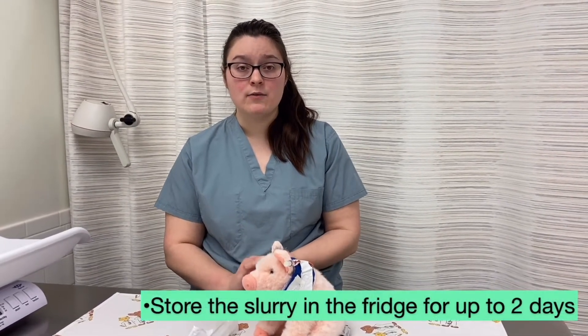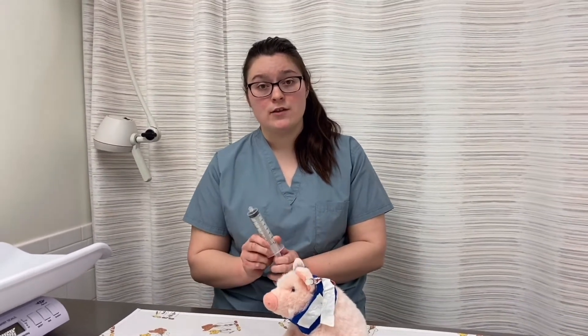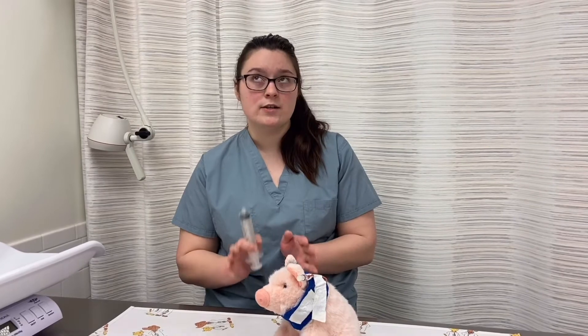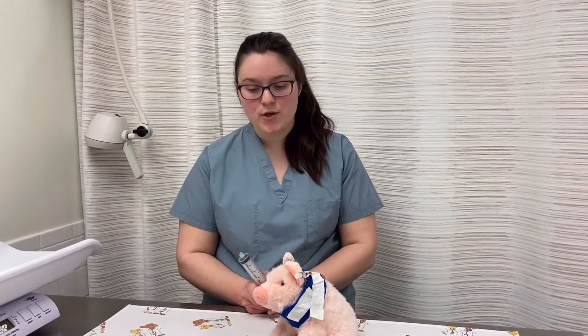You can keep the food in a container with a lid in your fridge, or you can pre-make the food in syringes and leave those in your fridge for about one to two days max. After that you would want to make more food and throw the rest out if you have not used it all.